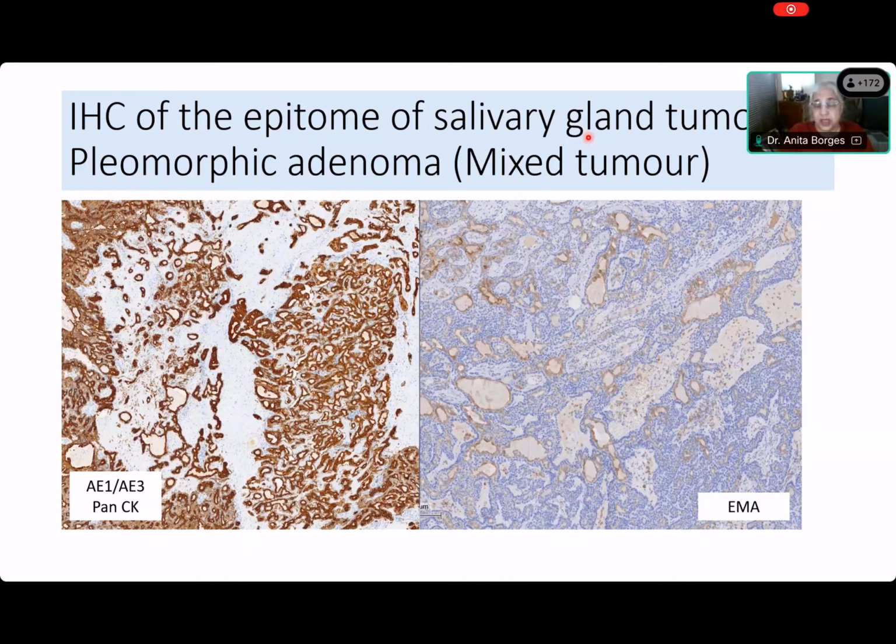and myoepithelial cells. The myoepithelial cells are making this chondromyxoid matrix. They are basal or basaloid in nature. They are not basal cells, they are basaloid. What is the meaning of the word basaloid, please, Madhu? Isn't it cells like in basal cell carcinoma? I don't want to know about basal cell carcinoma. I'm talking about salivary gland. What is the meaning of the word basaloid?